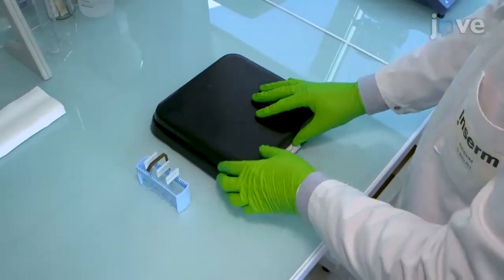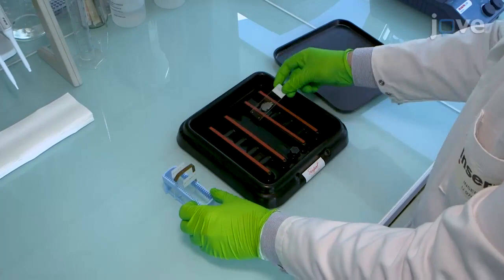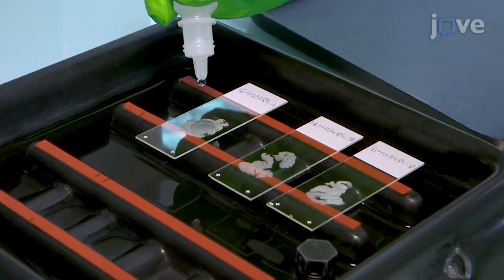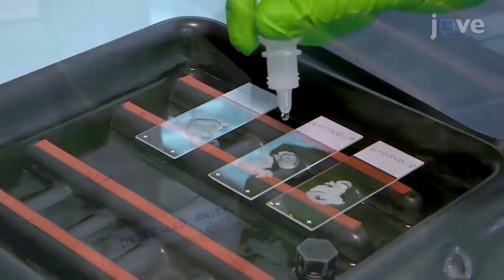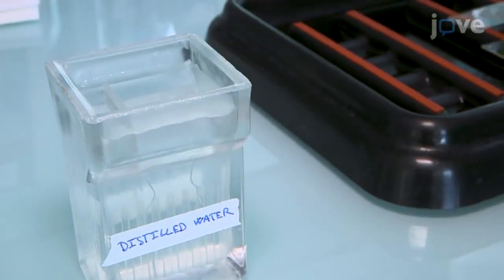To block peroxidase activity on slides with tissue sections previously deparaffinized and placed in a slide rack, add 4 to 6 drops — just enough to cover the sample — of hydrogen peroxide to each slide, and incubate them for 10 minutes at room temperature. Wash the slides 2 times for 2 minutes in distilled water at room temperature.